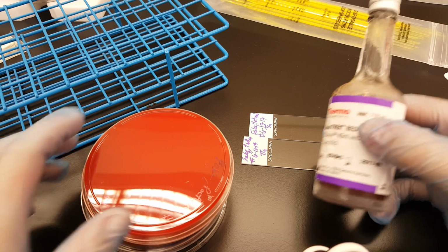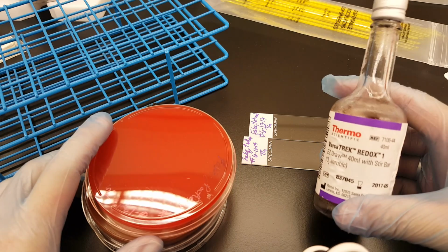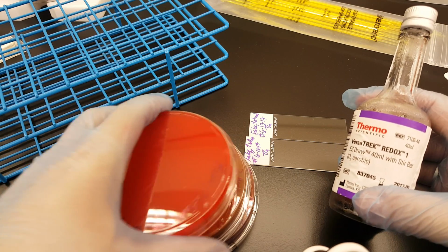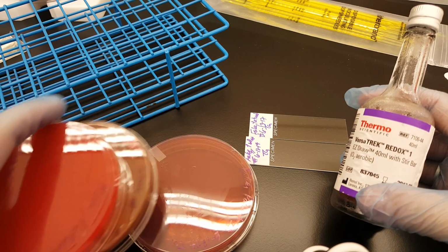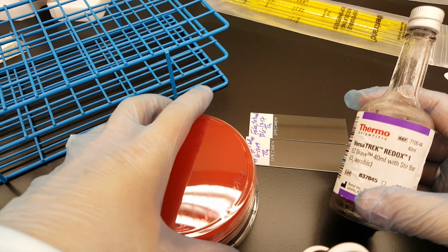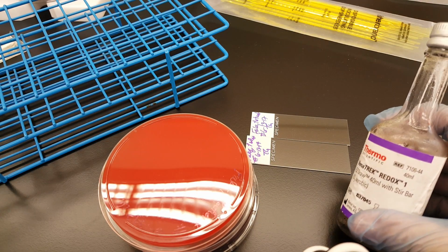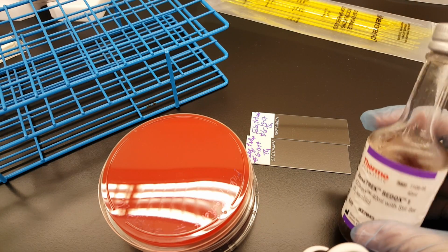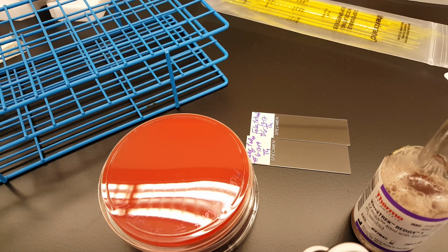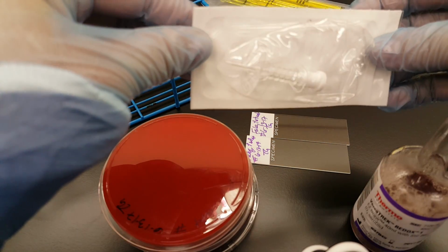Today we are going to sub an aerobic blood culture bottle onto the inoculation media. Again, it's aerobic, so we're just doing a blood, chocolate, and McConkey plate and 2 smears as our primary setup. What we're going to use is a safety sub device.